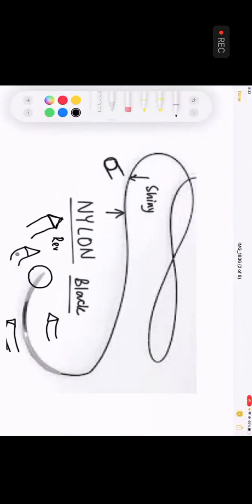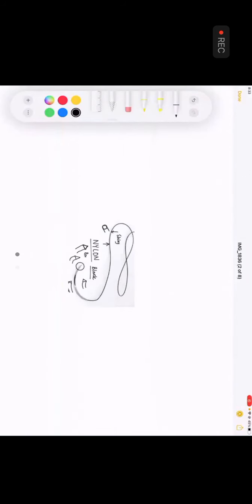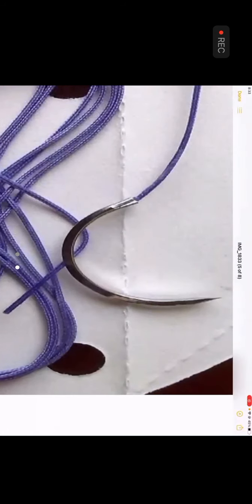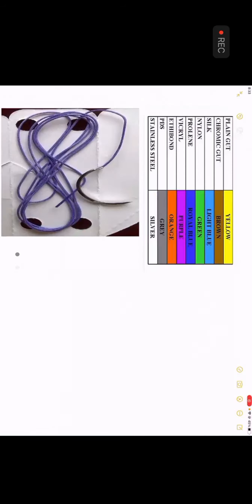In this picture, where is the apex of the triangle pointing? So difficult, I know that. It is very difficult to understand in 2 dimensions until and unless you feel it. Now see this one. Again, what do you think this one is, sir? Reverse. Okay. So this one is reverse cutting. Very good. You understood it.